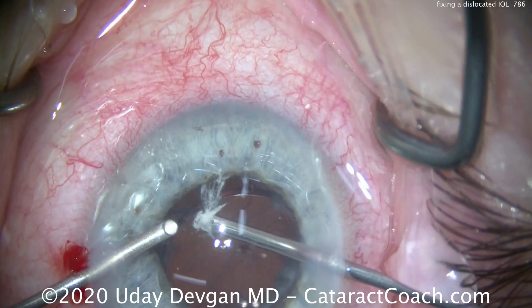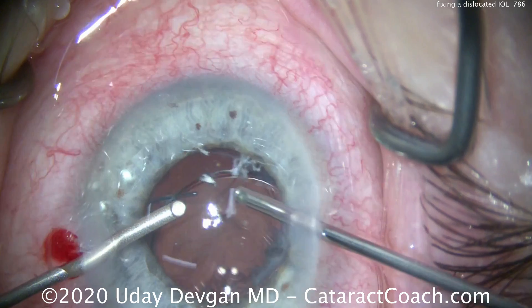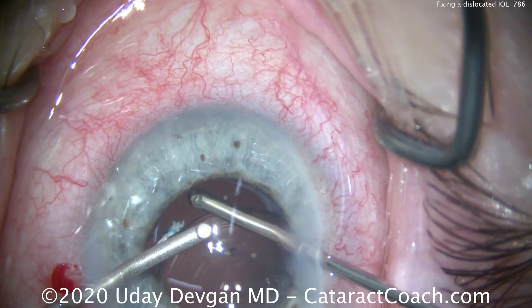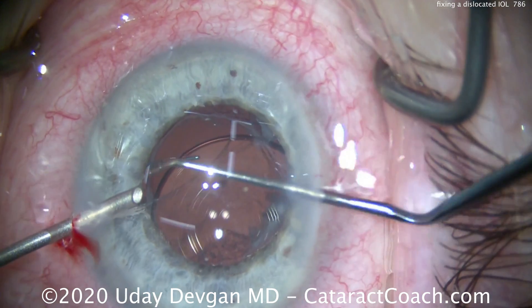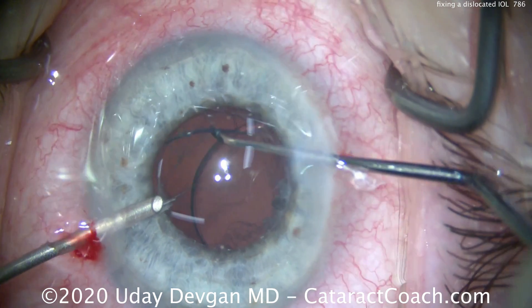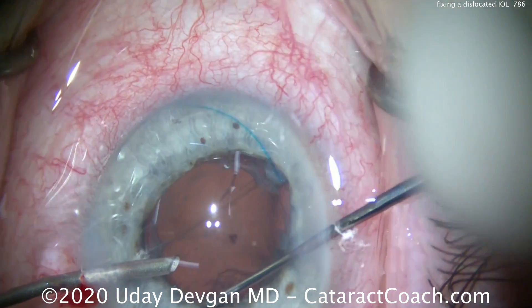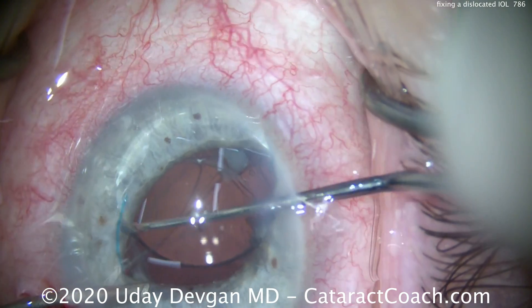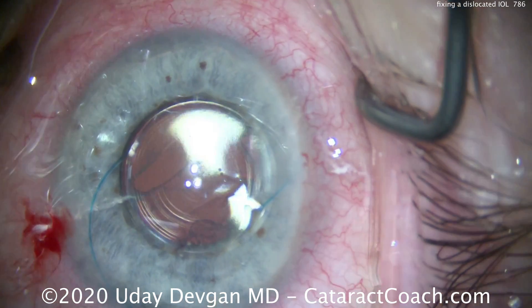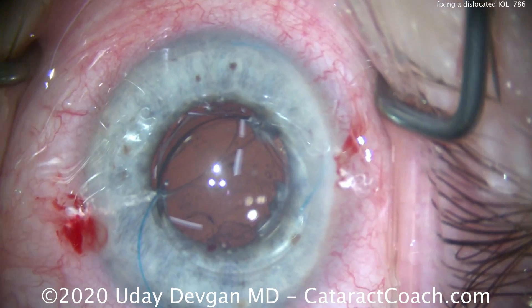We can use the vitrectomy cutter at a very high cut rate of 4,000 cuts per minute to help remove some of that prolapsed vitreous, but it's tough with the lens there. So let's bring the IOL up into the anterior chamber temporarily — bring out one haptic, then the other, getting the entire IOL into the anterior chamber. Then we'll place our vitrectomy instrument and infusion underneath the optic to do a really complete and thorough anterior vitrectomy.